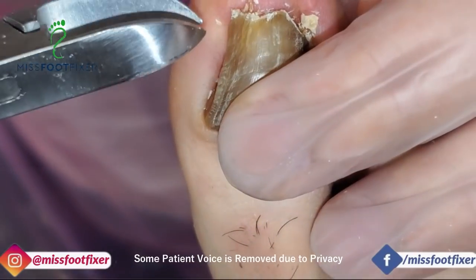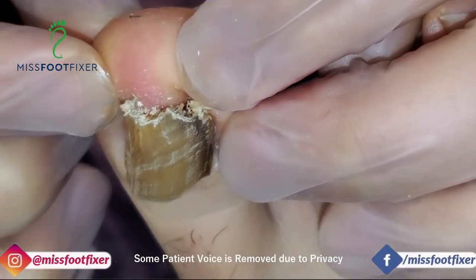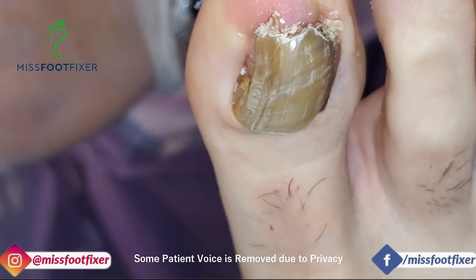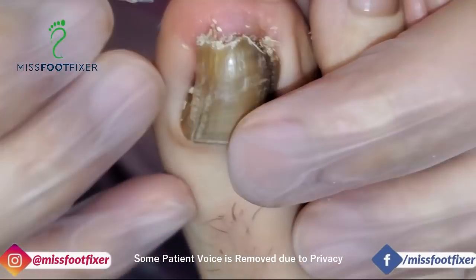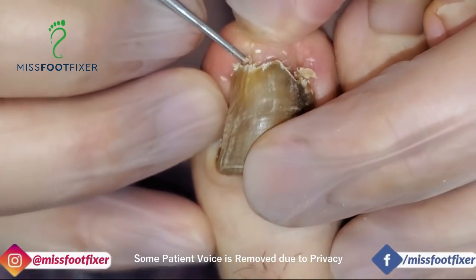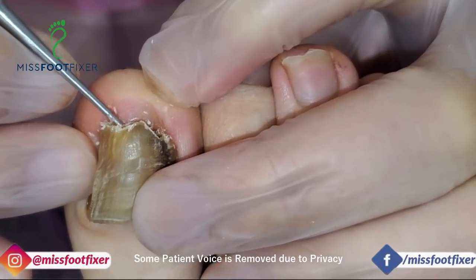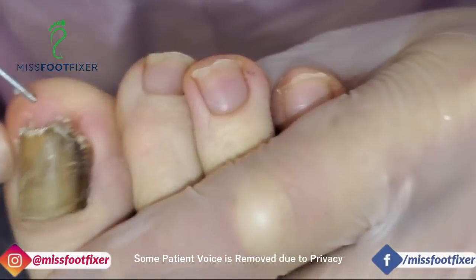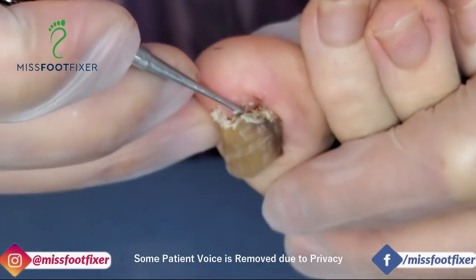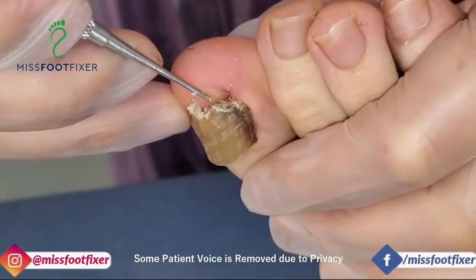But it's very involuted. Can you see? Yeah, use the black file. You see it's curved. This is going to be a bit hard to do. I'm not cutting. I'm just getting rid of all the gunk underneath. Yeah, that will help. So look, I can put this quite far in. This is not attached. I'm not actually cutting anything.